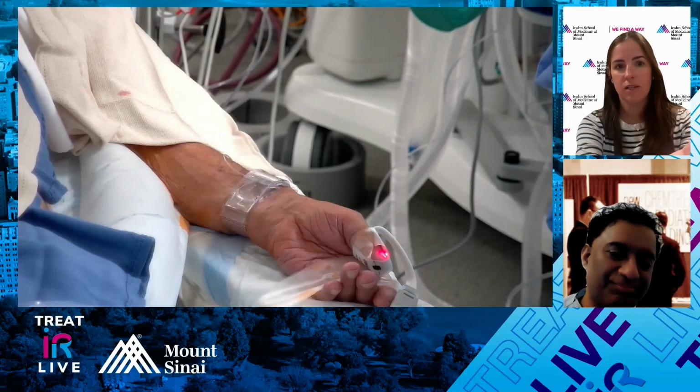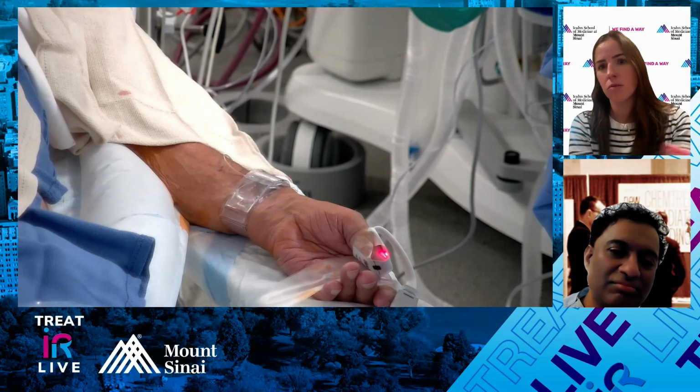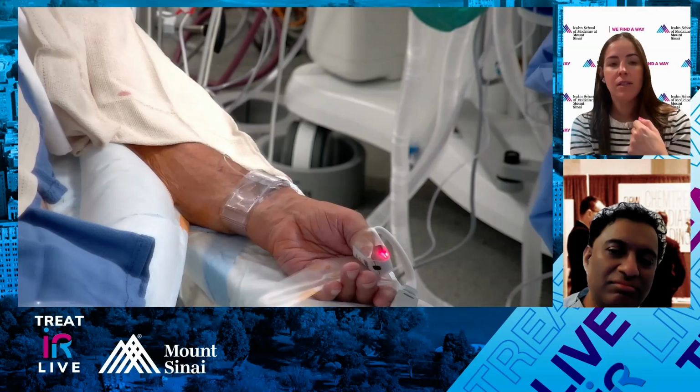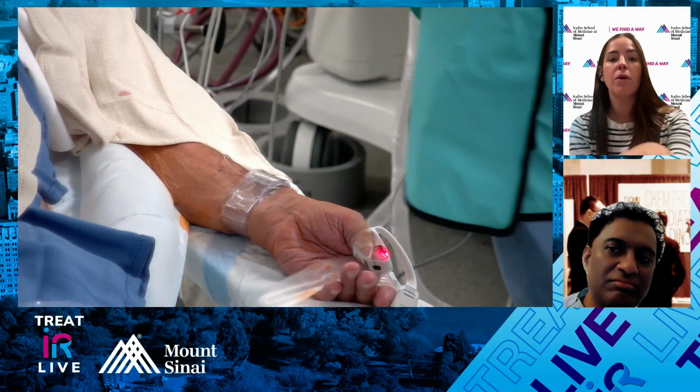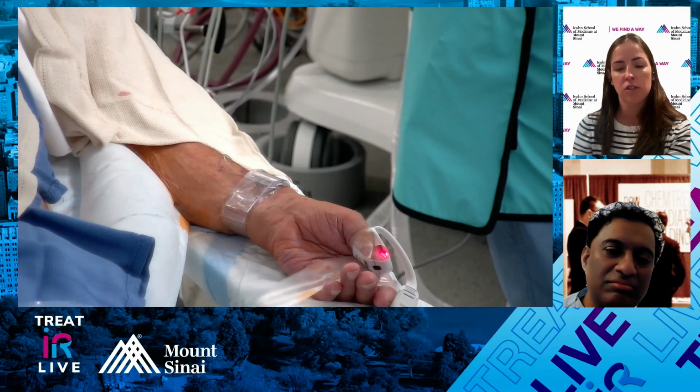So there are two ways that he's monitoring. Sometimes you can't feel the pulse exactly because maybe you accessed a little too low and your TR band is over the distal forearm or the wrist, but you can always put on the O2 sat monitor. And if you have a good waveform, it's perfusing.